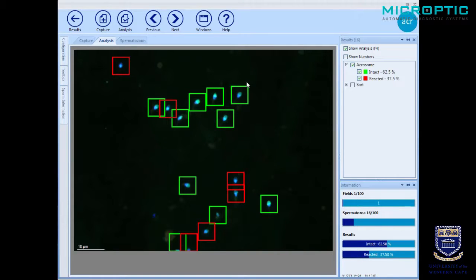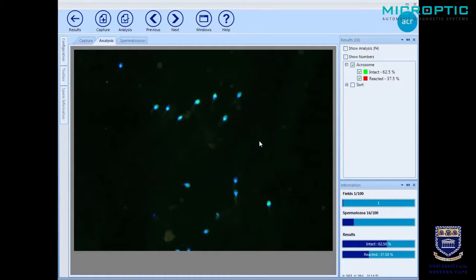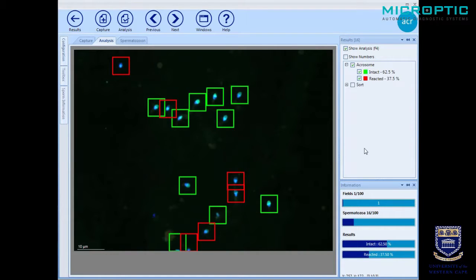Those with acrosomes have a green block around them and you can clearly see the green fluorescence. Whereas this one has a dark blue where the acrosome is supposed to be. That is a partly reacted acrosome, but because it's mainly blue, it will be seen as reacted — which is correct. If we remove the blocks, you can see how easy it is, even with the naked eye, to distinguish the clear green acrosomes versus those which are either without an acrosome or acrosome-reacted. The program detects correctly whether a sperm has an acrosome or not.